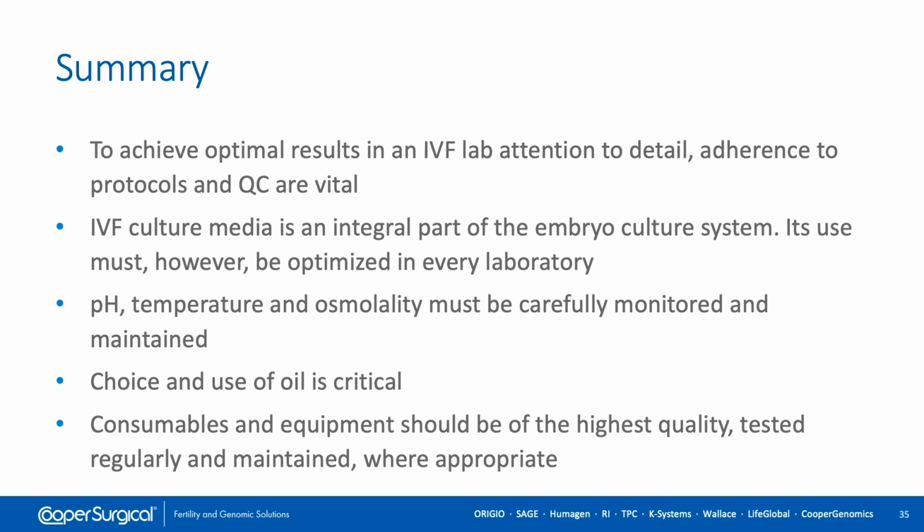And of course, consumables and equipment in the laboratory need to be of the highest quality. They need to be tested regularly to make sure they remain within the specification, and of course maintained where appropriate and on a regular basis, and records kept for that. So that's a brief summary of what we need to do in the laboratory to optimize our conditions. There are obviously other things that we haven't touched upon today. We mentioned air quality. We need to look at KPIs for our laboratory to ensure that everything's going as well as it should. But hopefully that will give you some food for thought when our labs are reopened and we get back to somewhere near normality.